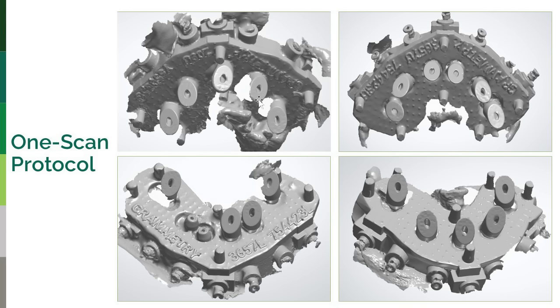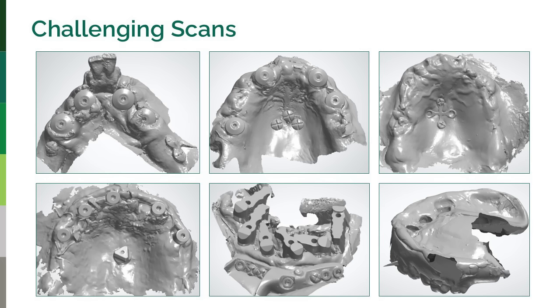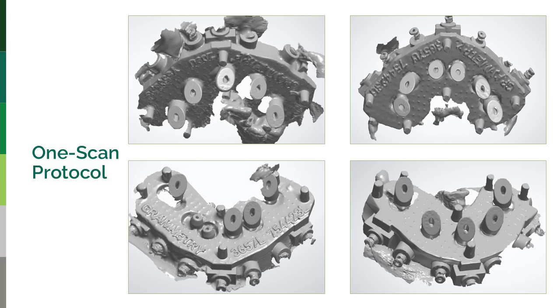You'll put a scan body in here. Any of the scan bodies on the market, especially the full arch ones, are really better suited for multiple implants in a case, kind of like you see here with their arch bridge scan body, a very accurate titanium scan body, easy to scan left to right. And then once you have scanned the scan bodies, you just continue around and scan the scan guide. Just seconds, scan the whole thing. And then you'll upload it.